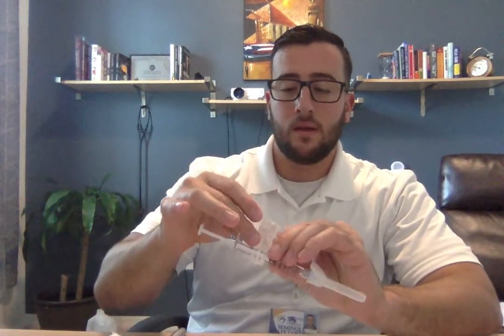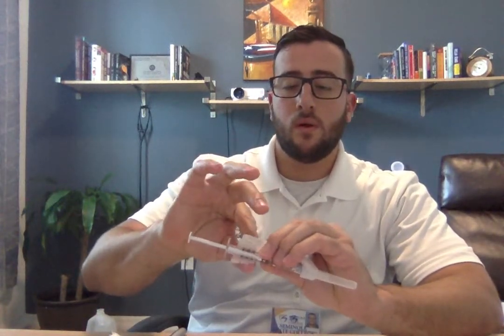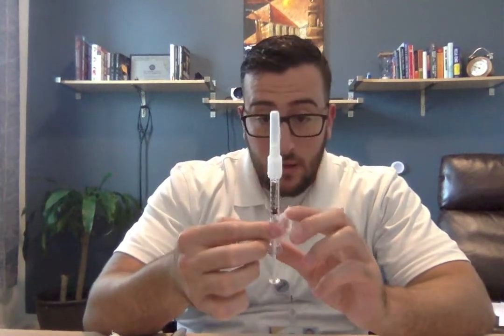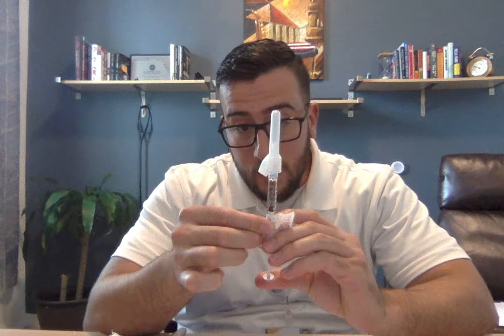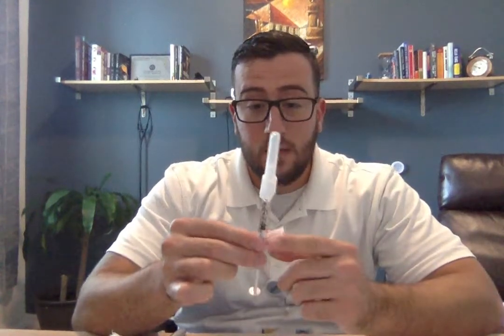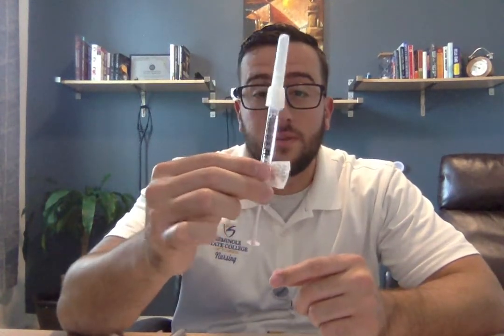Okay, I'm going to go ahead and place this on here, being sure not to cover the amount on the medication administration label. All right, so again, 0.5 ml, perfect. All right, so I have this ready.